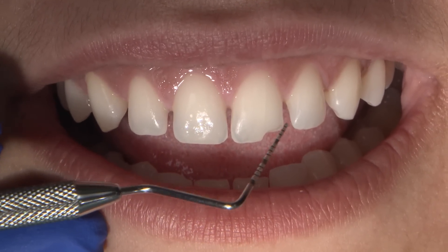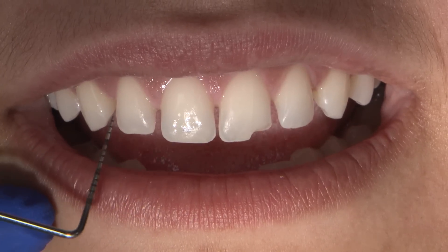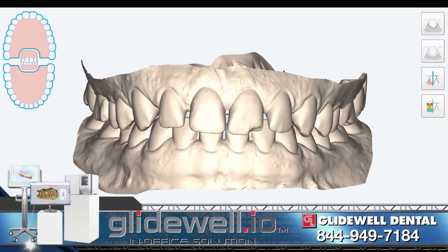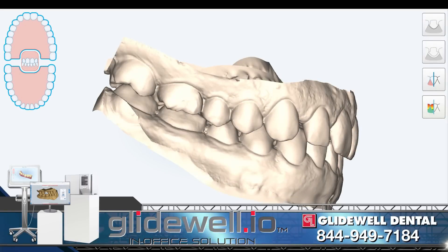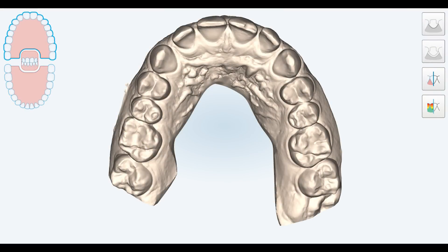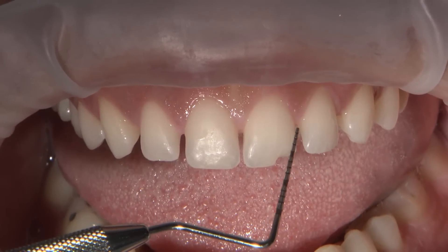Welcome back again. Let's dive right into where we left off from the last episode. The patient is back now, six weeks after the laser gingivectomy. This case was a complete digital case from the scan and design, all the way to the final restoration. With the iTero Element intraoral scan, I obtained a digital impression. In the scan image, we can see the amount of gingival tissue I removed and the nice tissue response I got after six weeks.